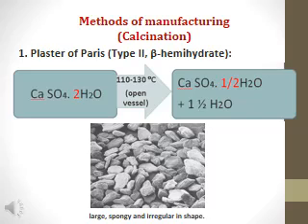This is manufactured by heating the crushed gypsum, which is calcium sulfate dihydrate, in an open vessel, heated at from 110 to 130 degrees centigrade. Okay, there are no precautions taken in this process. It is a very primitive technique without any precautions, as I said.